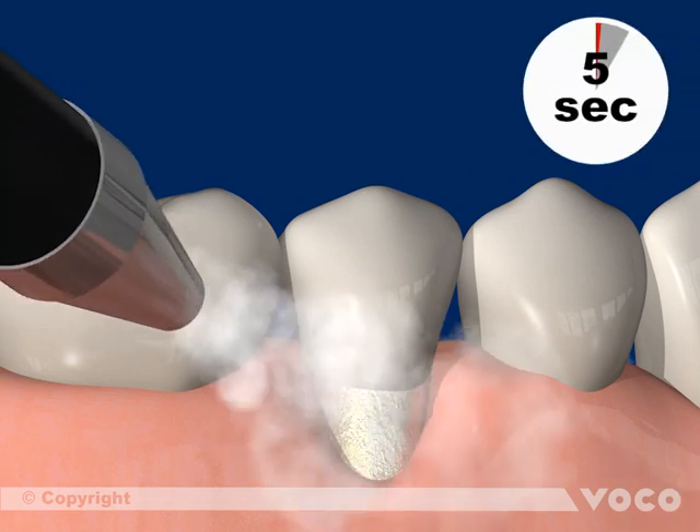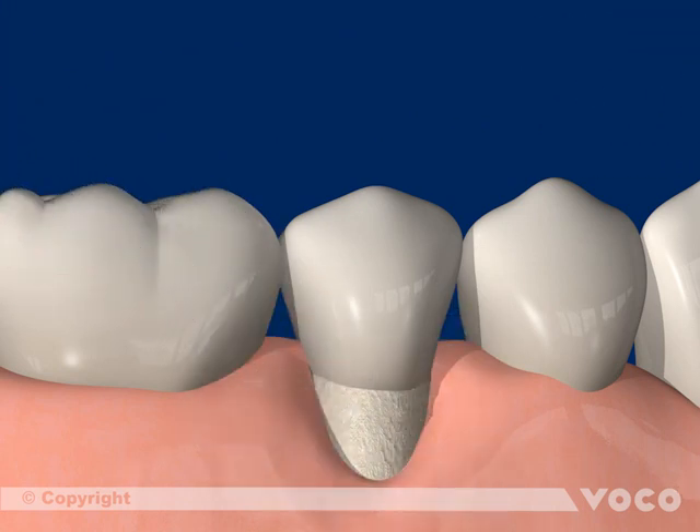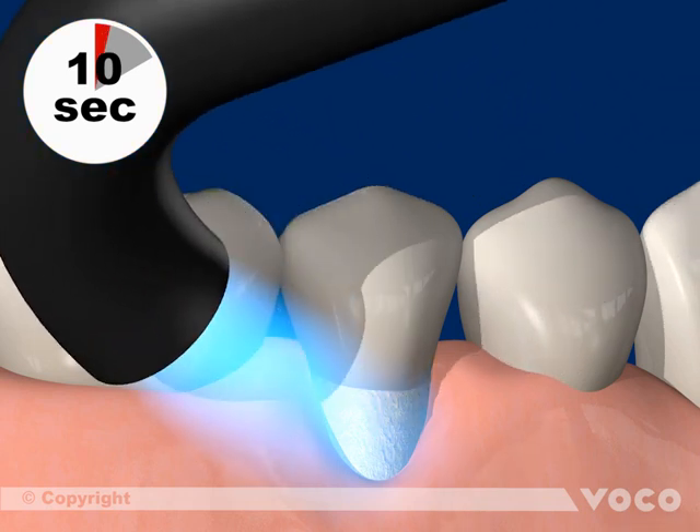Solvents are removed by drying the adhesive layer with dry, oil-free air for 5 seconds. Then the material is light cured for 10 seconds, which polymerizes the adhesive layer completely.